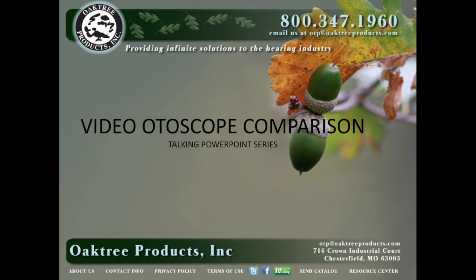Hi everyone, this is AU Bankitis with Oaktree Products, and today's Talking PowerPoint compares a couple of popular video otoscopes.